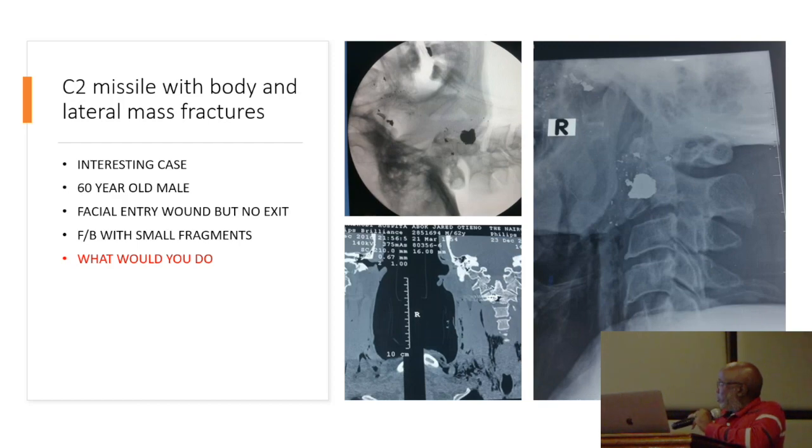I saw he had an entry wound on the face, but no exit wound. So we took an X-ray and saw this. The only thing is that he was bleeding, of course, from the nose. And the question was what to do. Neurologically, okay.